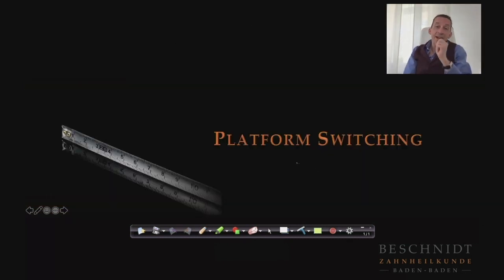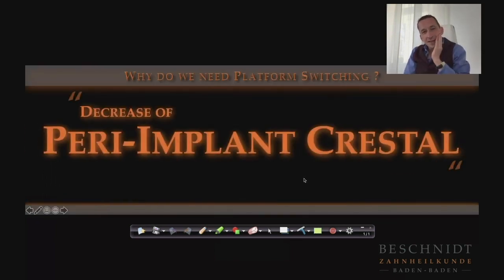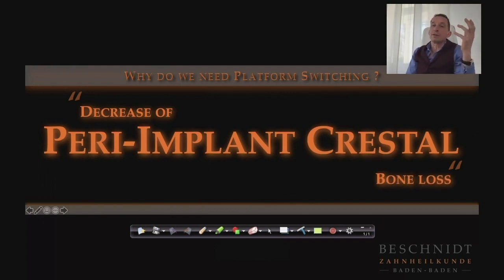Now let's have a look at the platform switching. Why do we need platform switching? It is the decrease of peri-implant crestal bone loss. And for a long time, we didn't really know if this is functioning and how much of this platform switching is necessary.